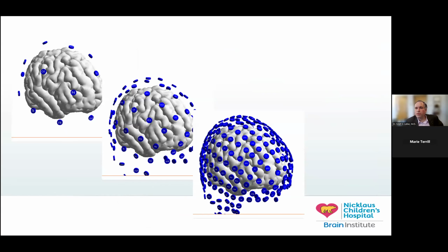So here's a solution for us, right? As I mentioned, we were talking about the idea that the EEG, because we have a small number of electrodes, because the activity is being attenuated when coming out and being dammed together on the scalp, is looking at the brain like it's essentially a very smooth surface. By increasing our number of electrodes, we have one solution towards how we can improve our resolution.